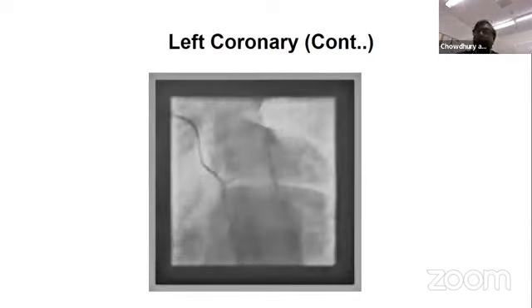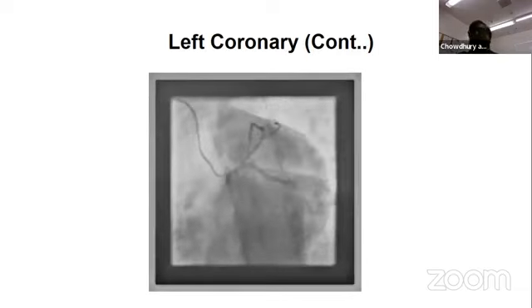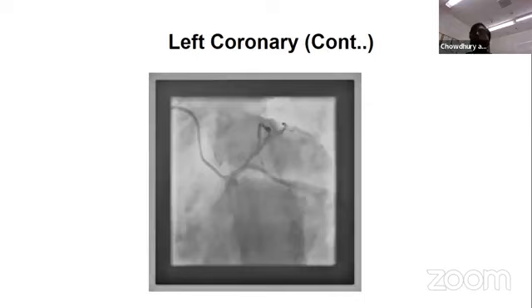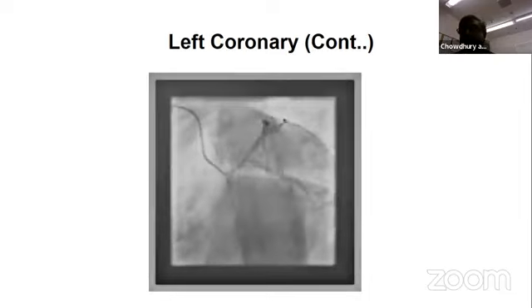And the other possibility, which is less likely, I think, but I'm just giving you a differential, is that people can present with Takotsubo like this. In those cases, you can see EKG changes, but not these deep Q waves. Usually Q waves are not that bad and almost non-existent in ST elevations in Takotsubo presentation.